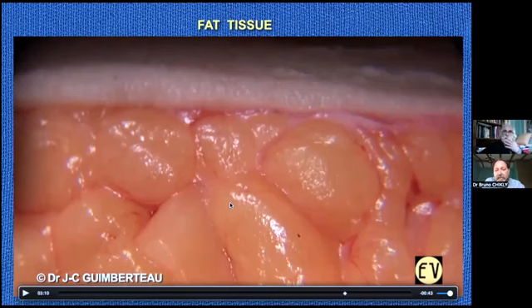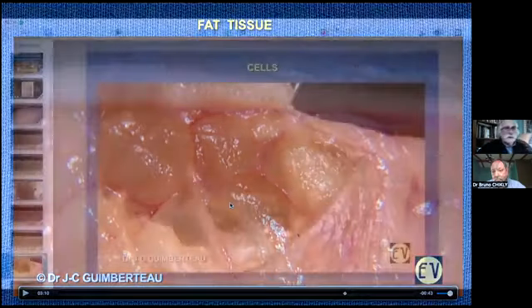So I see one vessel in the middle of the desert. I don't see a nice network of vessels trying to go to every cell. It's really one vessel that you see here and there, unless they come from the other side. Well, concerning the vessels and the cells, do you want to see some now? Yeah, let's see some vessels. I imagine some cells are going to be vascularized and some much less. Well, yes, we can do it.